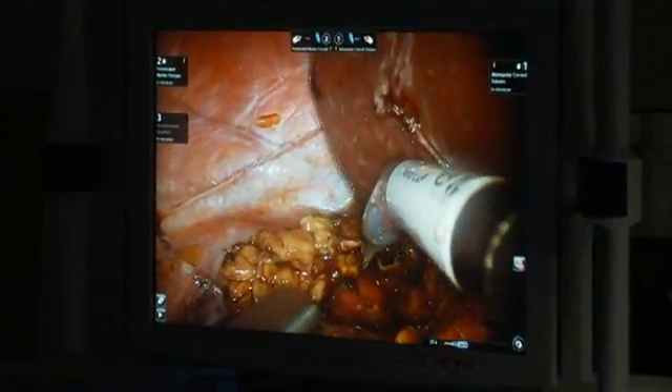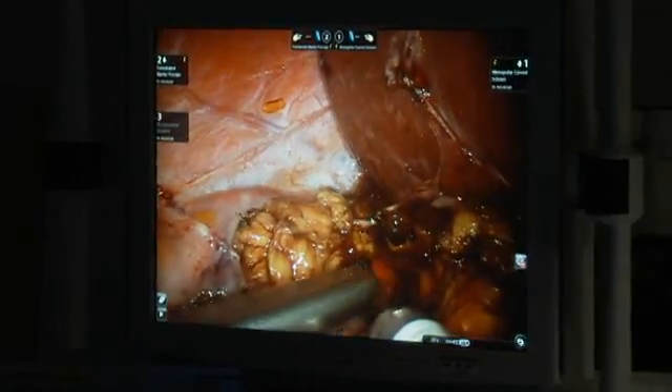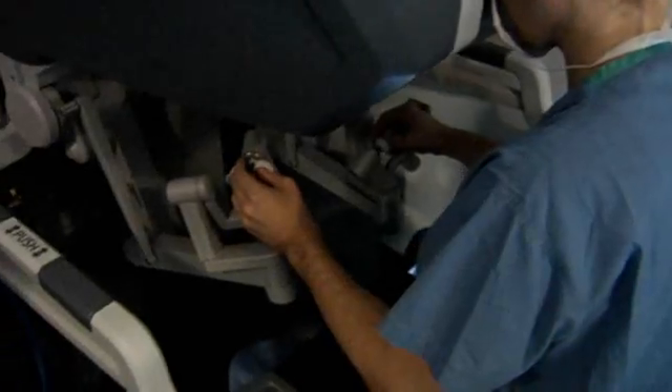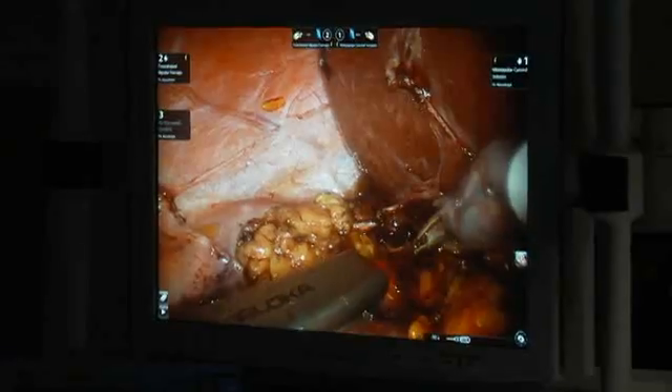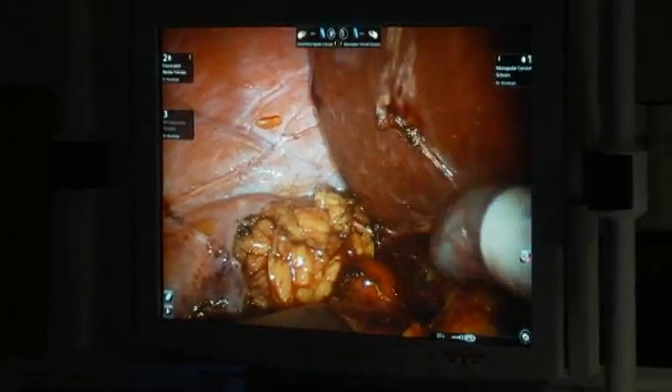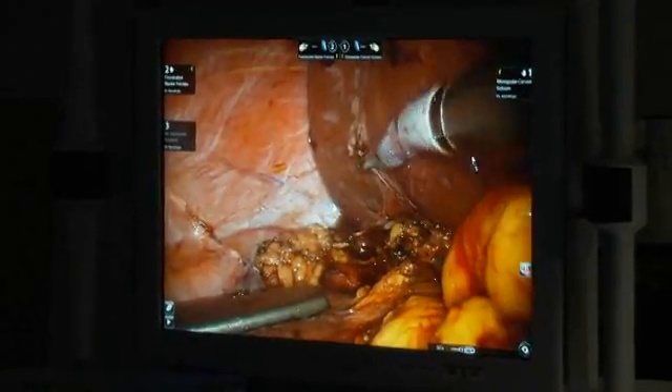This is the tumor right here. I'm going to ultrasound it. I can confirm my margins, which I've already marked out. I'm going to start resecting right around here and take the whole thing out. You can see it's very high up — this is the liver.